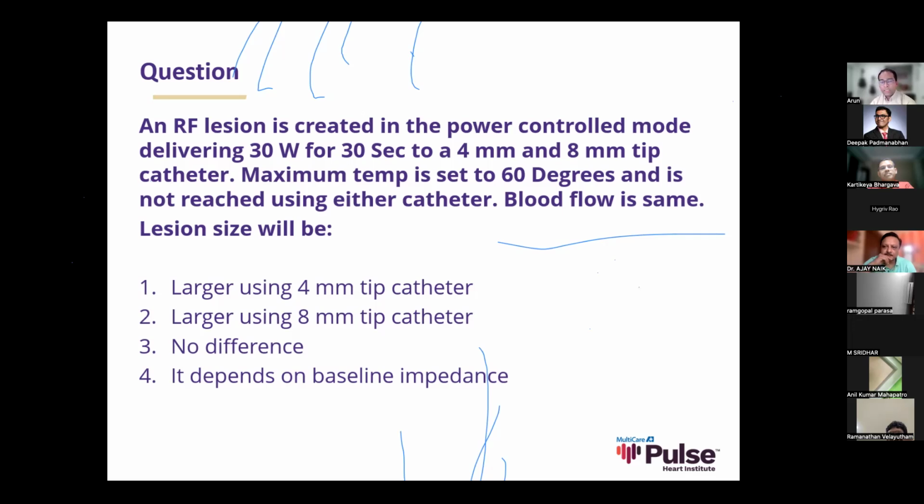In theory, speaking theoretically about what happens when you have a low impedance system, your ablation becomes inefficient. You have to deliver more power to achieve the same lesion, because the current goes in and comes out of the system with little dissipation of power. When your impedance is low, the amount of power dissipated in the system is low. That's what is happening, but we don't really care about how many joules we are losing, right? So I think that is okay. As for safety of the system, I have to go by what you're saying. It is probably okay with that impedance.